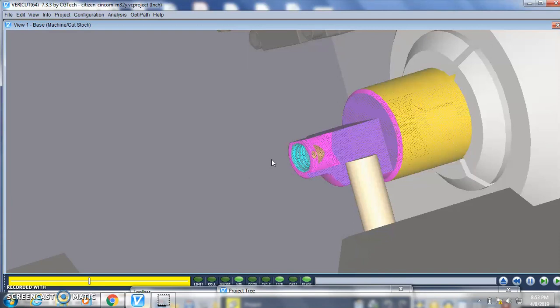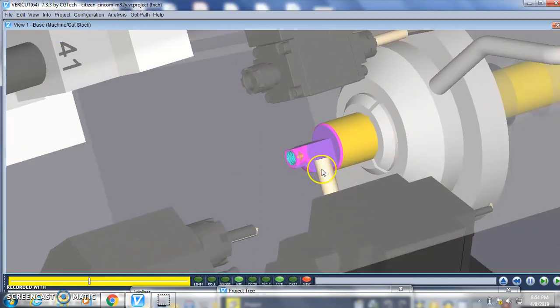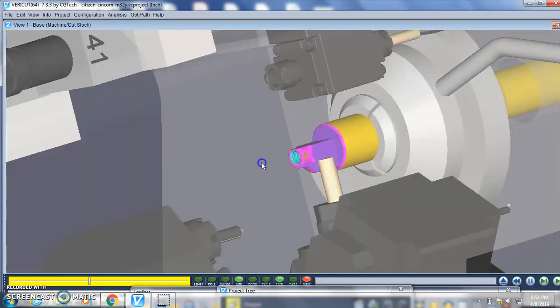When you look at threads, most of the medical threads start with Buttress threads, Acme threads, and different IQ-Lock. Most of these threads are either double lead or triple lead. So I will walk you through how to program double lead threads or triple lead threads. So let's look at the simulation.